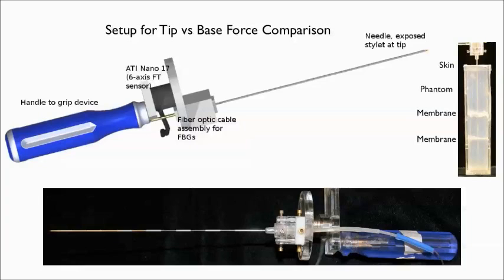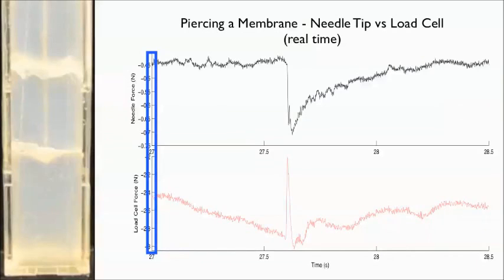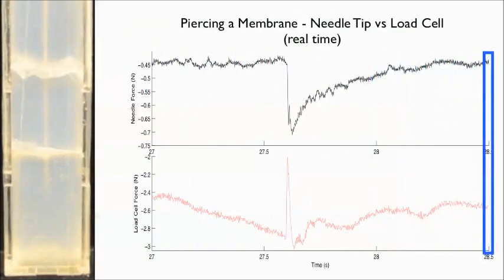The needle was outfitted with a 6-axis force torque sensor at its base to compare loads to those felt by the fiber optic sensors at the needle tip.